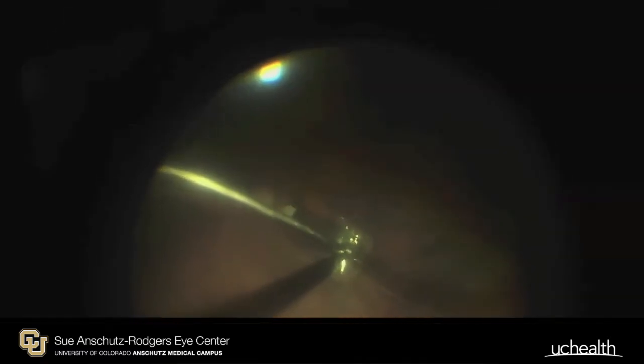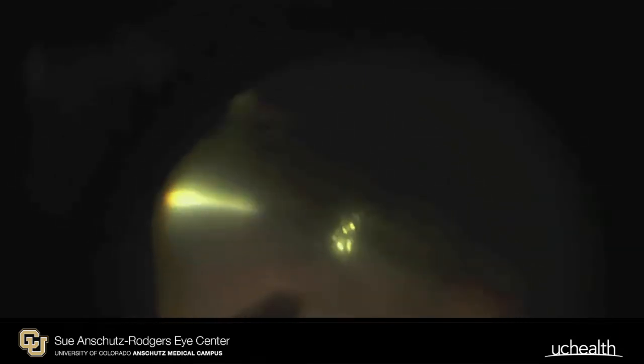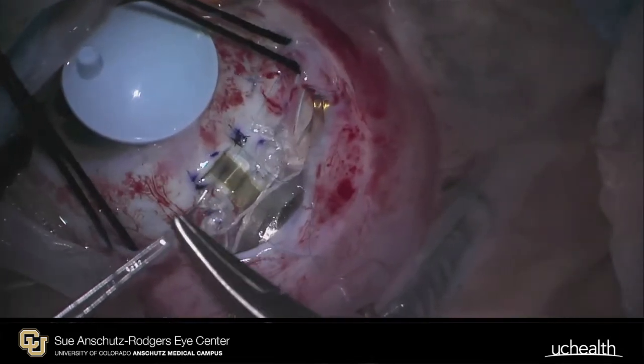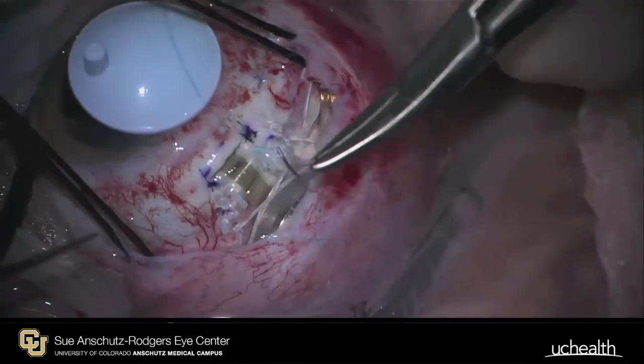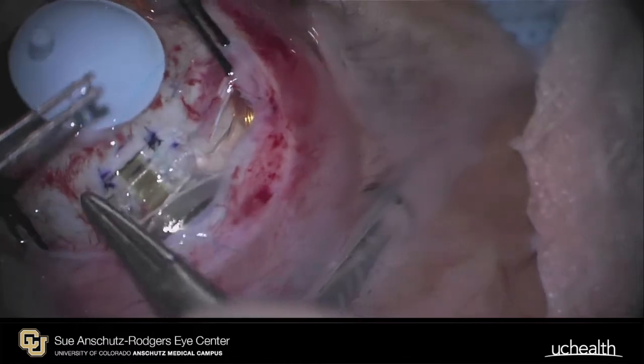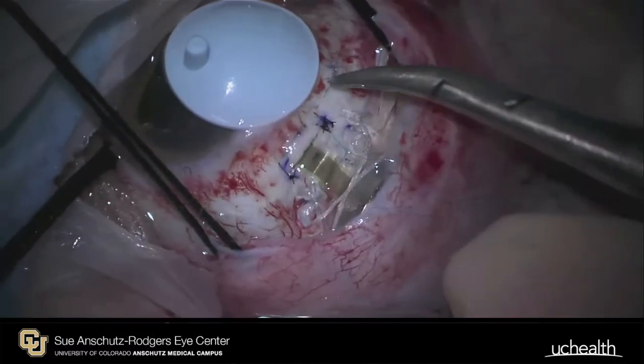The tack cannot be repositioned after this maneuver. The insertion tool is carefully removed from the tack. Finally, the sclerotomy wound must be rendered watertight. In this case, this is achieved using prolene suture passed in a purse-string fashion through sclera and around the cable.